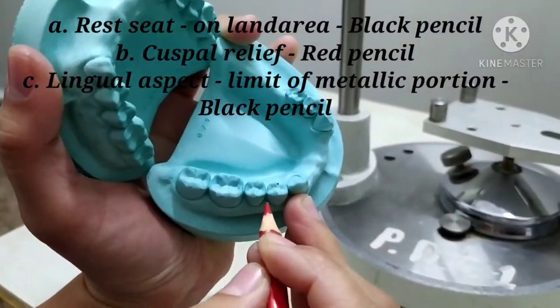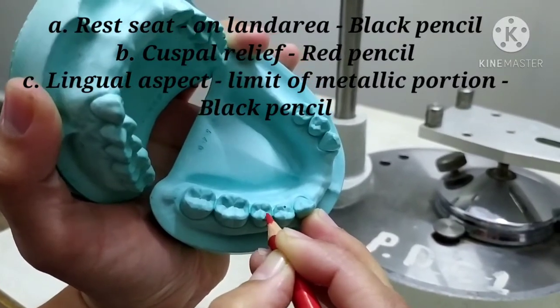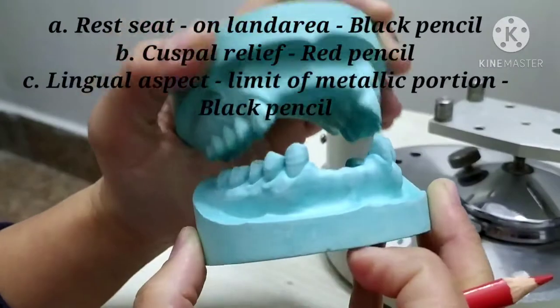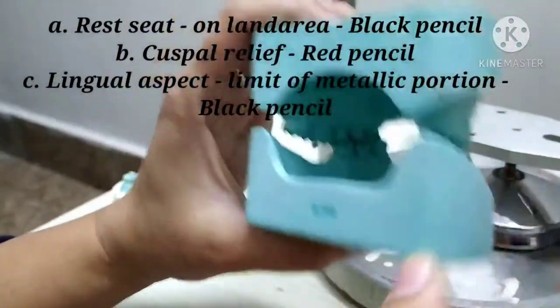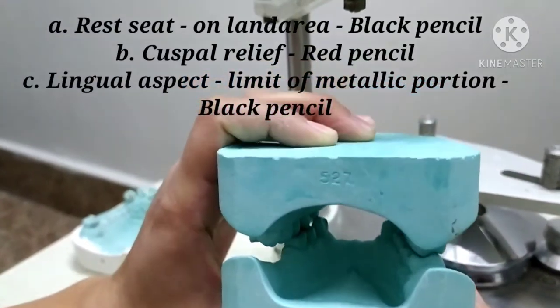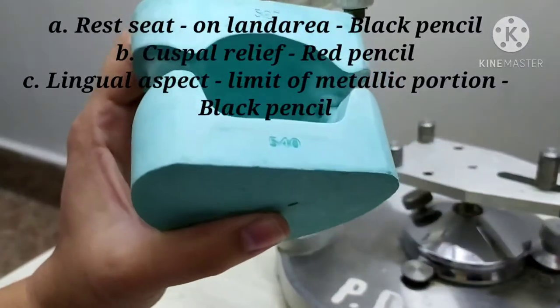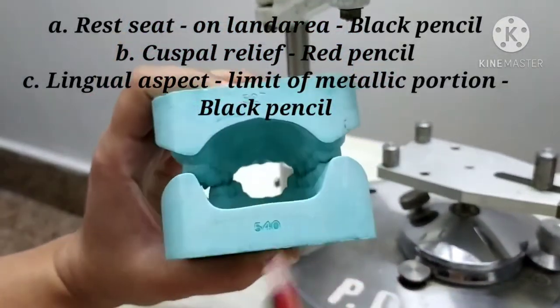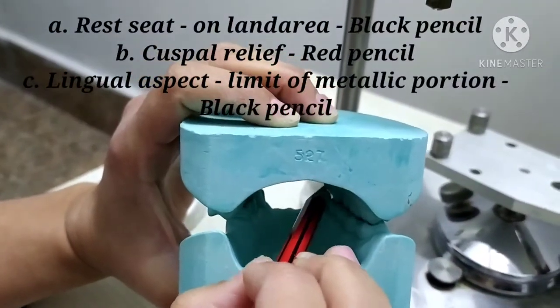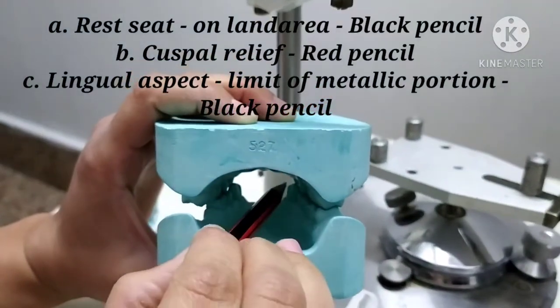If a cusp is interfering, then it is marked with a red line. In a later stage, this area has to be removed. The third point to evaluate is examination of the lingual aspect of the occluded cast. The lingual aspect is examined to check any clearance needed — the occlusal clearance for the cingulum rest or any extension of the metallic portions. Using a black pencil from the rear of the cast, a line is drawn on the lingual or palatal surface of the maxillary tooth, marking the line onto the palatal surface by taking the incisal edges of the lower teeth as a guide.